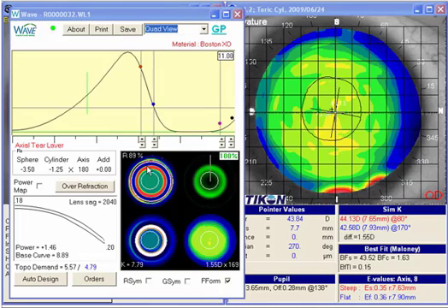So this is a standard straightforward lens here, and if we think about it, we've got a power of +1.46 based on the topo demand of 5.57 here, and the RX of -3.50. So by having a power of, we'll just call it 1.50 for even numbers, we have a power of +1.50 on this lens, and that's designed to get this cornea to about plano, or maybe a little hyperopic, maybe +1/4, +1/2.